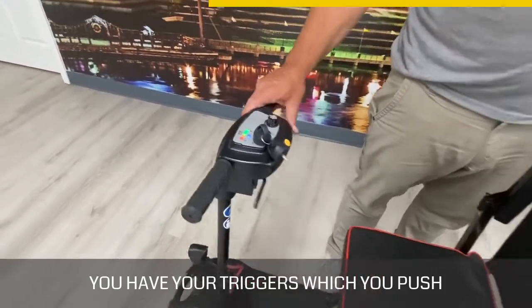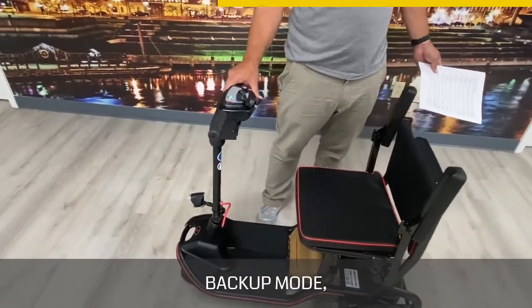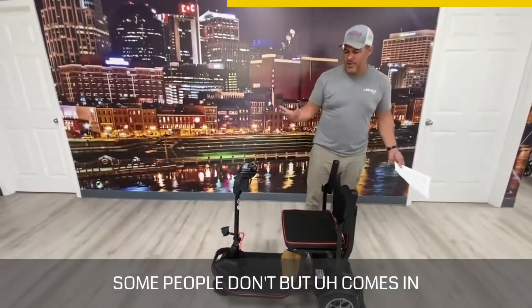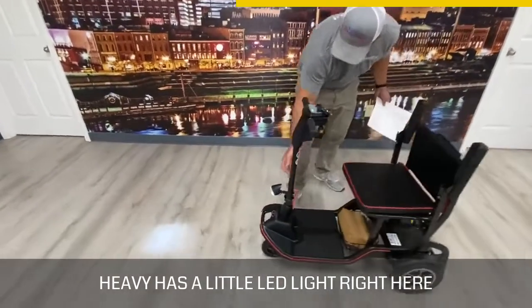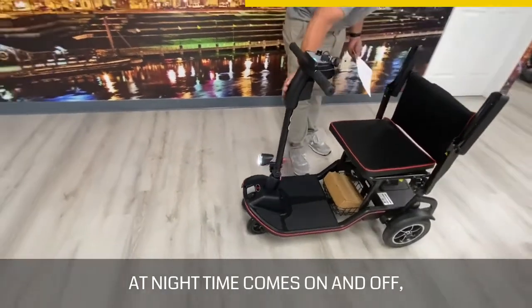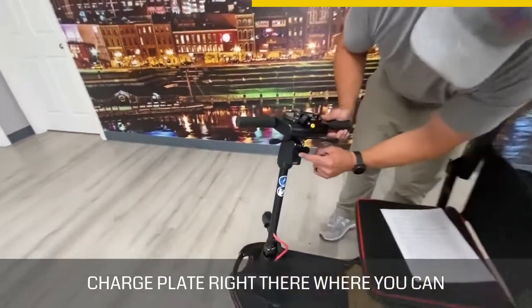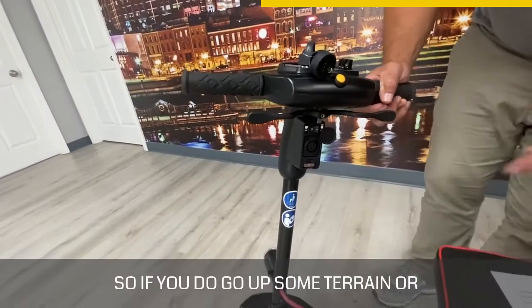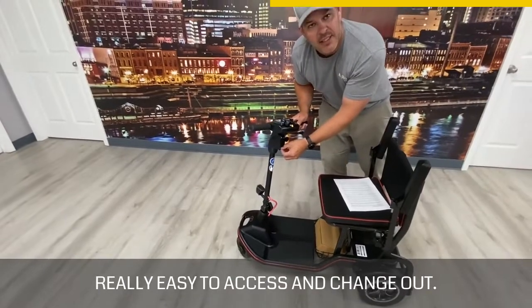You have your triggers which you push backwards and forwards. When you go into reverse, it has a backup mode so you hear it beep as it backs up — some people like that, some don't, but it comes in handy. It has a little LED light right here that has a bit of adjustment, which is a nice feature if you're out at nighttime. It also has a charge port right here where the regular charger plugs in, plus a fuse that's really easy to access and change out if you go over some terrain you shouldn't.